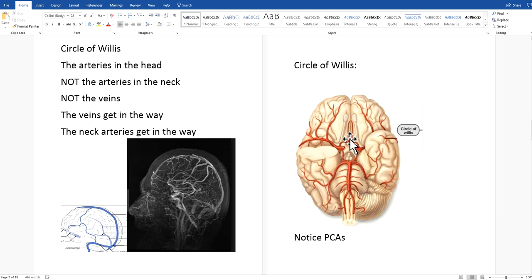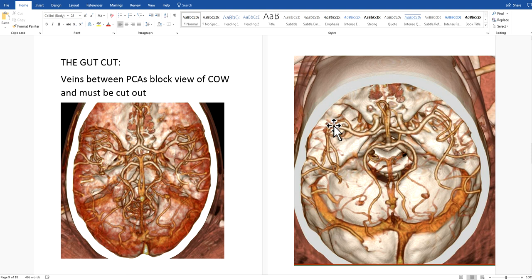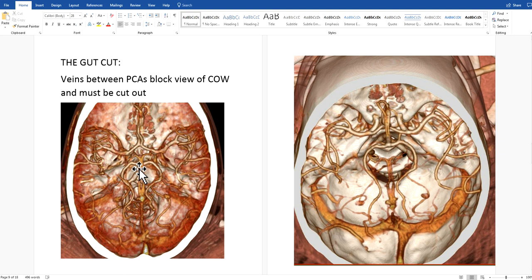Let's review the Circle of Willis. These are the arteries that run at the base of the brain. Going forward are the anterior cerebrals, to the side are the middle cerebrals, and going back are the posterior cerebrals. Pay attention to the posterior cerebrals because we have to make some cuts around them. Now I'm going to review some cuts we use to remove the veins. One is called the gut cut, because it reminds me of gutting a fish. It's a way to scoop out the veins that block our view of the COW. These central veins run deep here, lay over top of the COW, and obscure our view.